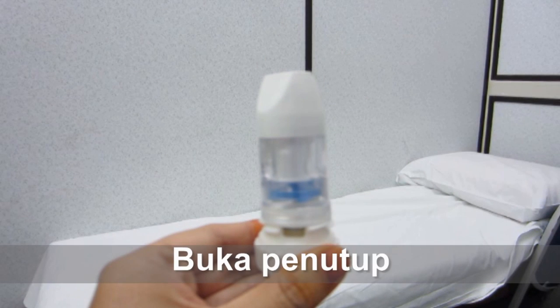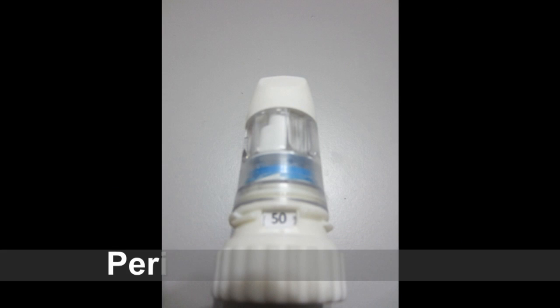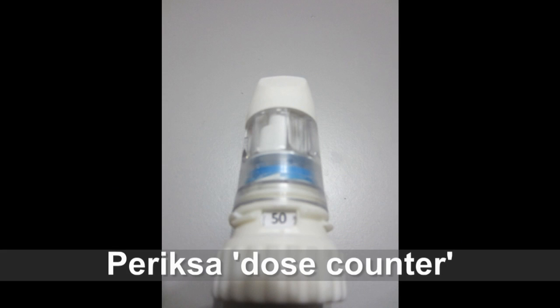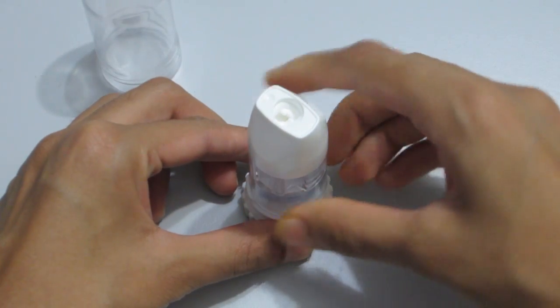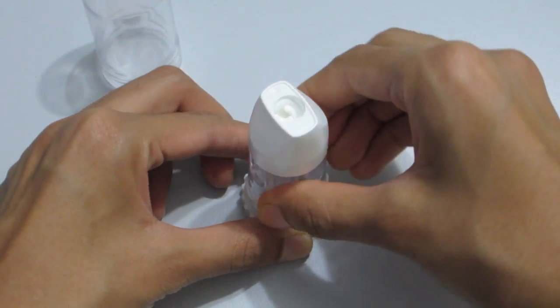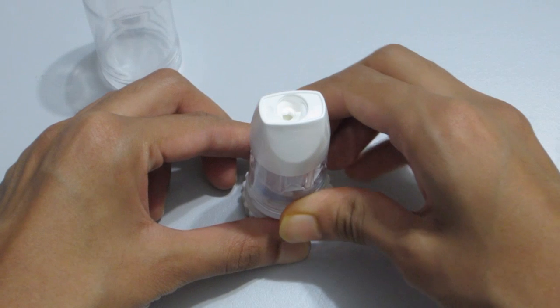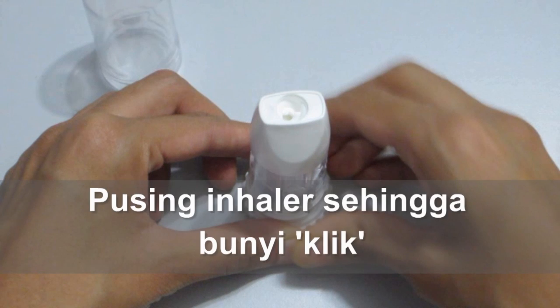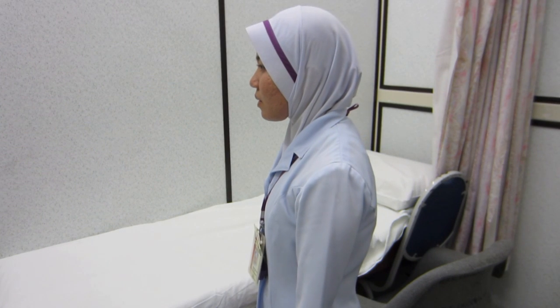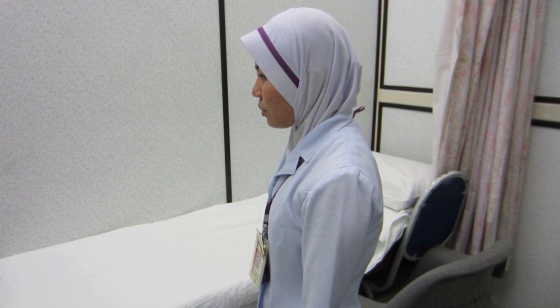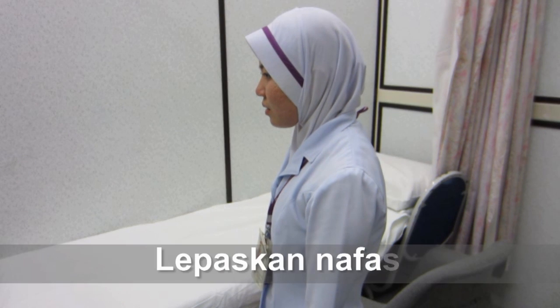Buka penutup inhaler. Periksa dos kaunter pada inhaler. Pegang turbohaler dengan tegak sebaiknya di atas meja. Pusingkan inhaler sehingga bunyi klik. Ikut arah pusingan jam kemudian bertentangan. Lepaskan nafas dahulu.